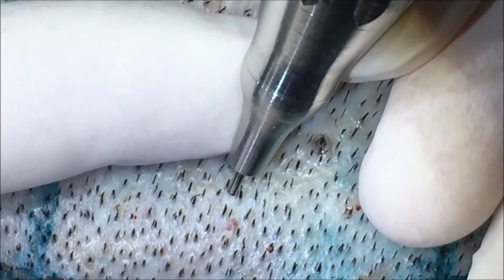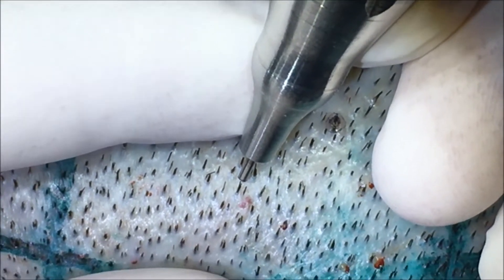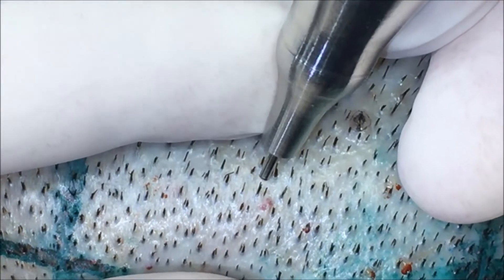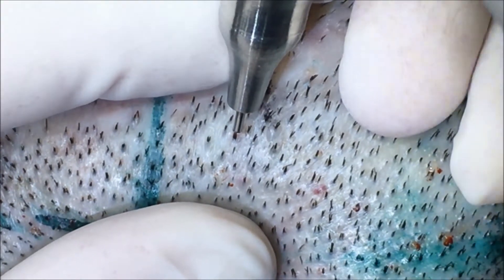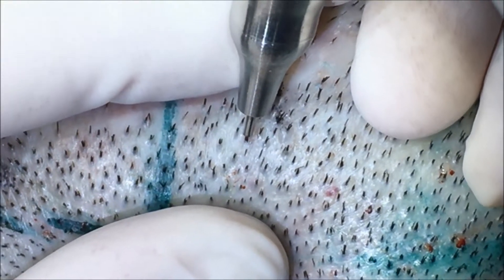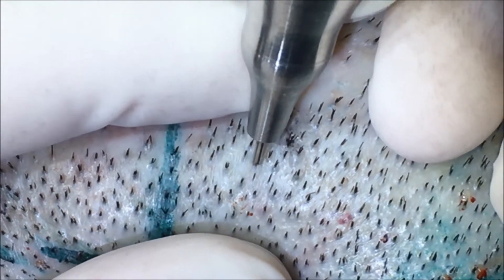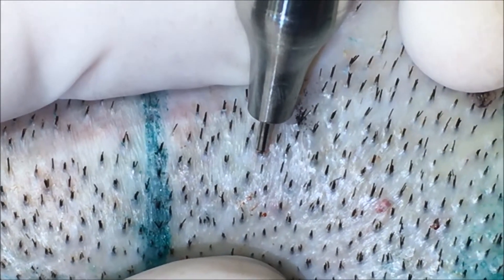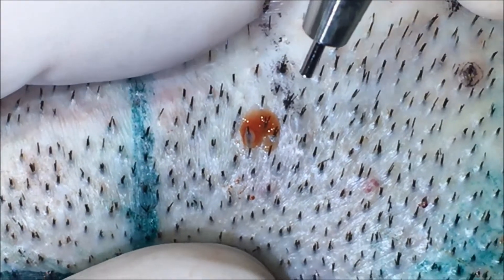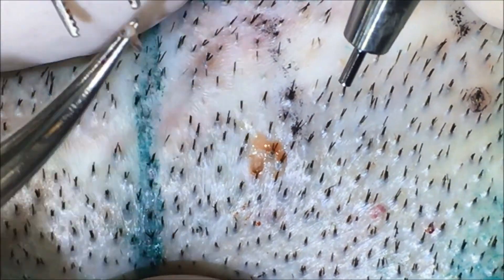The correct sequence for FUE extraction is: correct alignment — align the punch with the hair shaft's angle; the engagement of the punch, which means the lower border of the punch touching the skin; and finally, the penetration of the punch and the extraction.